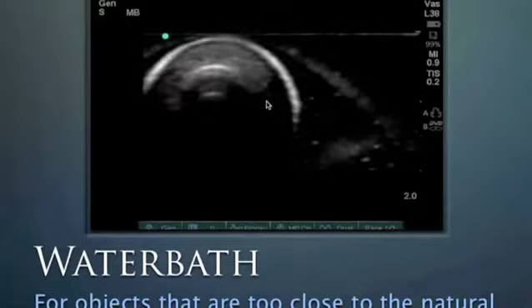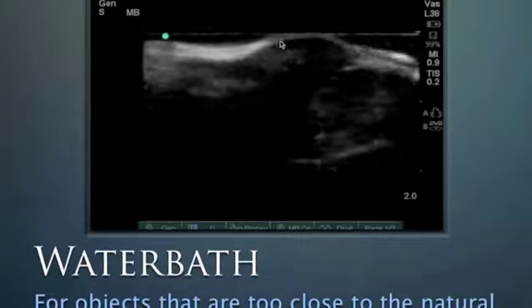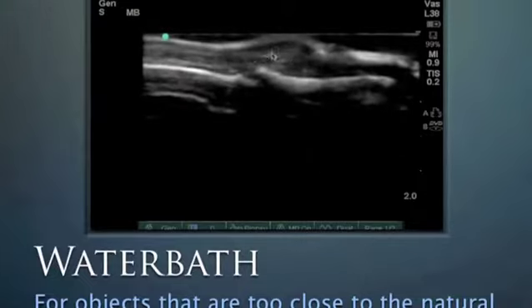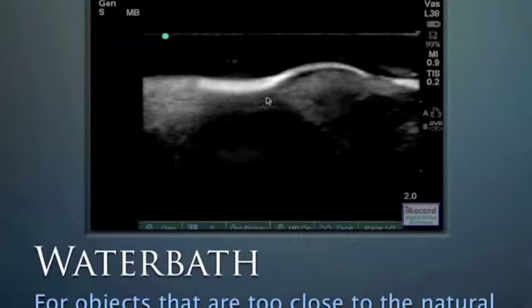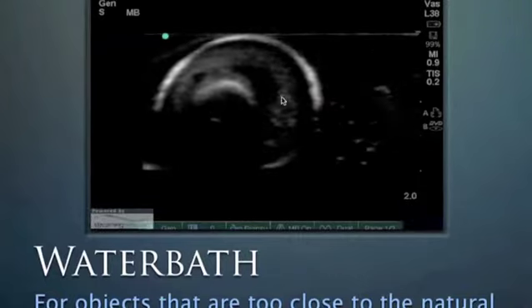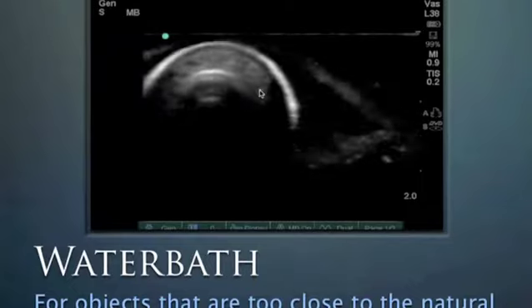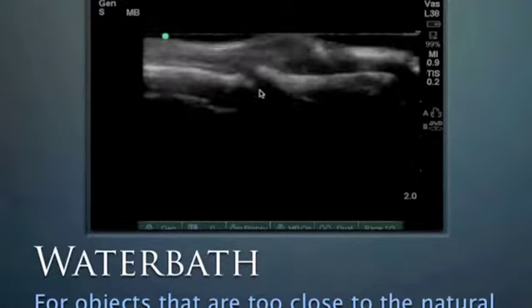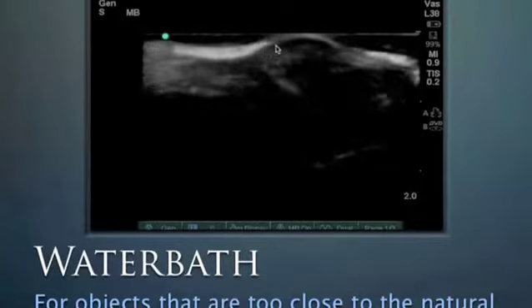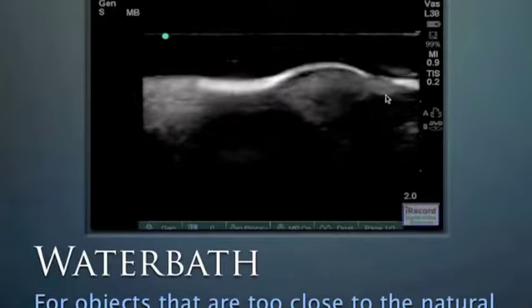Another digit with a paronychia — on the other aspect of the finger. In the water bath we can make out the paronychial area. Here it is in the short axis: a hypoechoic area. Moving into the long axis, we can see this area extending just right up to the nail. There's the nail bed, and then the paronychia adjacent to it.